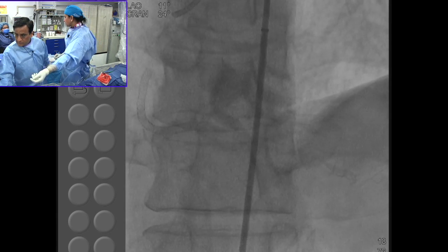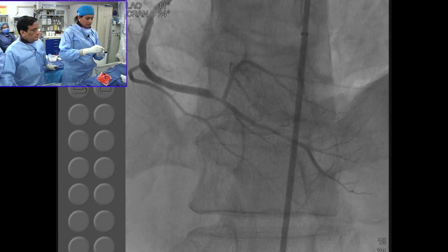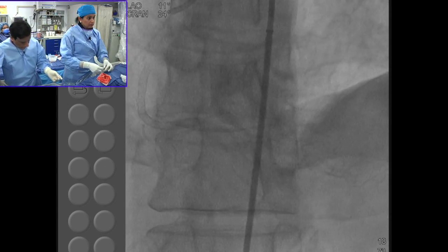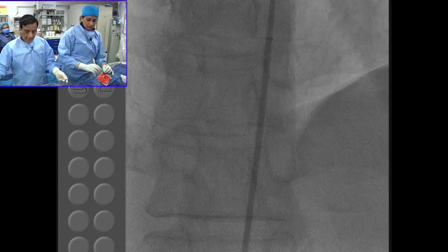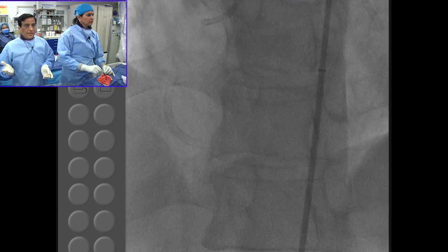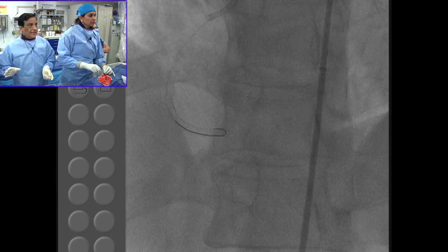One of the reasons, Anu, I would favor putting a stent is, now that we've dilated with the balloon, we might as well. But on the other hand, one could argue that we are just doing it to make a vessel look pretty. If you have done a very low pressure dilatation, which I do very commonly, I don't feel that I am obliged to put a stent. You are just increasing the distal flow. Remember with all these lesions, when you put a stent, there is a vertical displacement of the plaque. So what you're doing with the low pressure is just tacking that up.